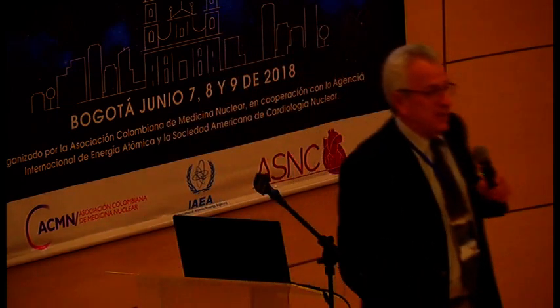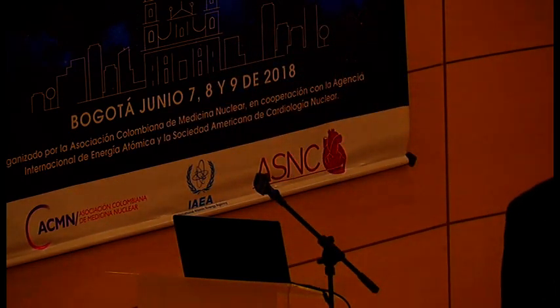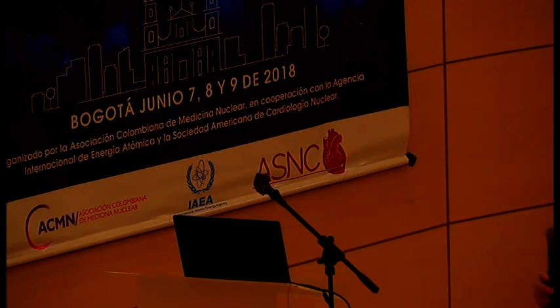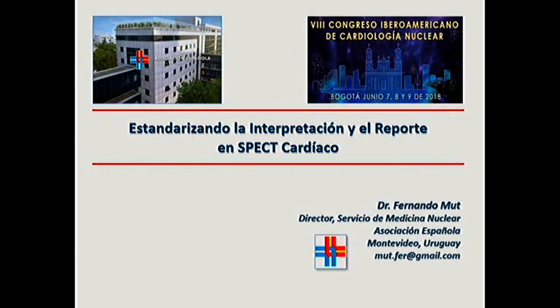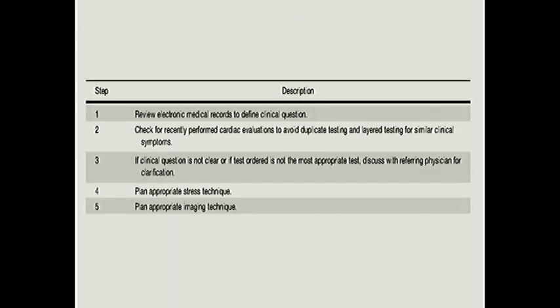Of course, people who are already experienced in nuclear cardiology, I'm not going to be teaching you anything, I'm not going to be suggesting anything, but those who are just starting can probably take a couple of considerations from this lecture. And of course, it is also useful to review some aspects. This was taken from the American report, and it mentions a couple of important things.